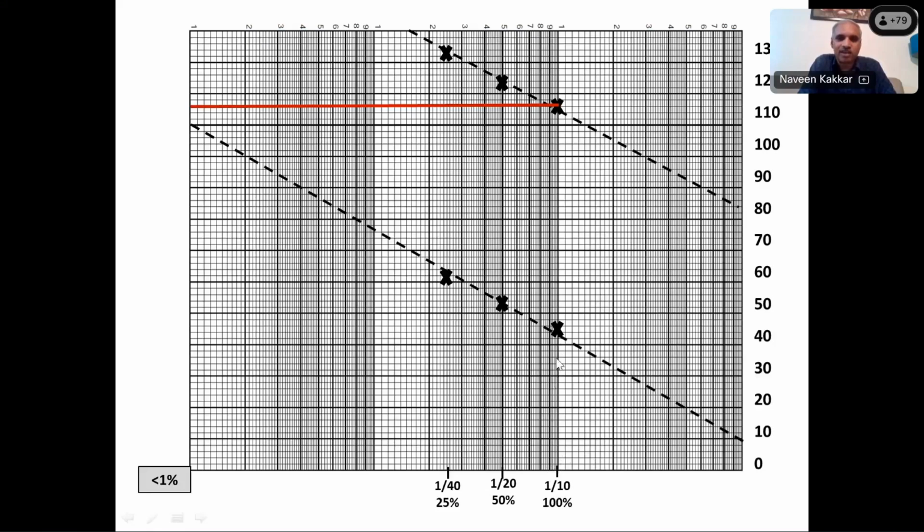So if you had 500 microliter, add 500 microliter of buffer. That makes it 1 in 20. To another tube, use half of this and add 500 microliter of buffer again, and that reduces it down to half again. So on this axis now I have arbitrarily assigned factor levels of 100%, 50%, and 25%.